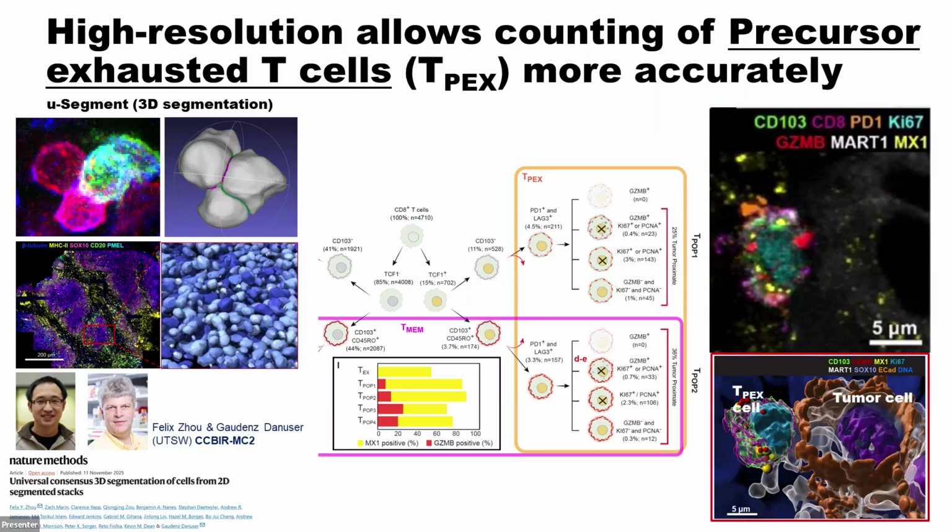But that's only a small community of cells. Have you done it on the whole tissue yet? We have, and we deployed this to another cell type that is a hot topic right now. Exhausted progenitor cells, or TPEX cells, are trendy because they give rise to new T cells that can combat disease.